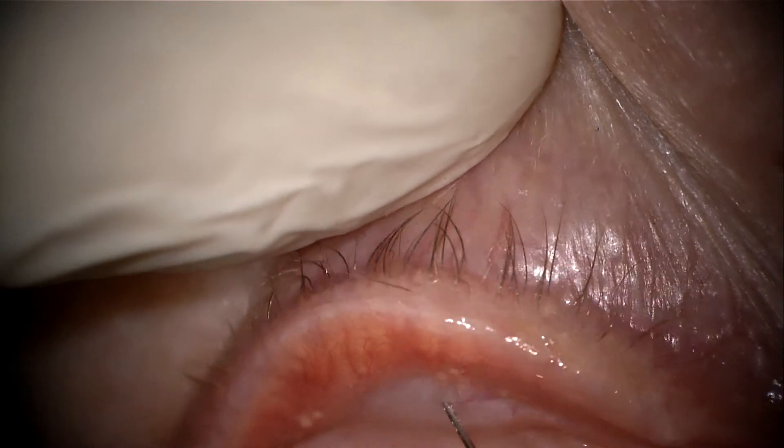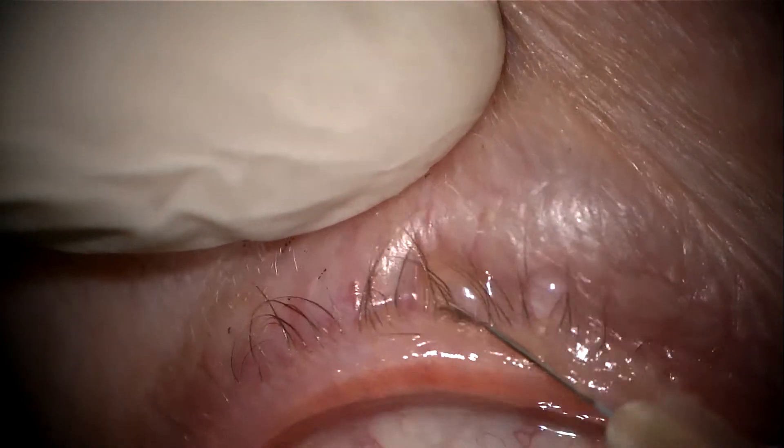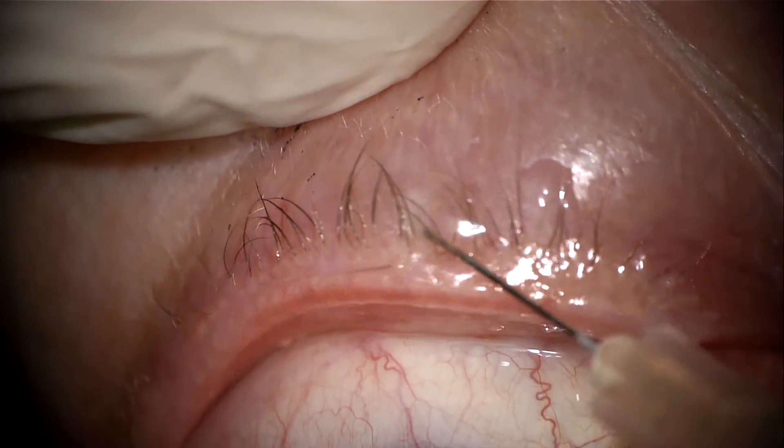I would recommend doing the whole of this procedure under microscopic visualization, as these eyelashes can easily be missed. A transcutaneous route is also then approached for the anesthetic.